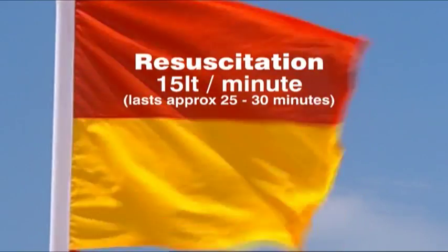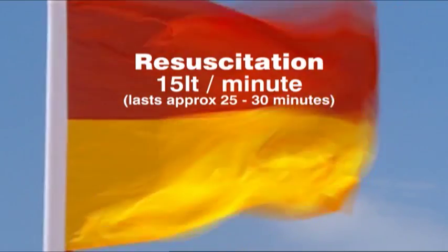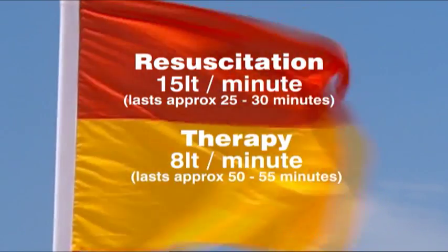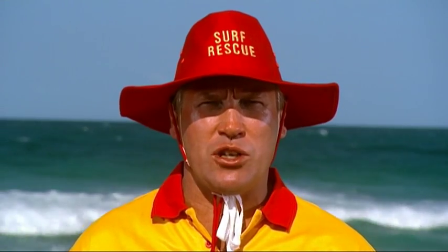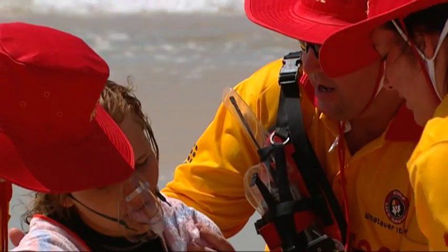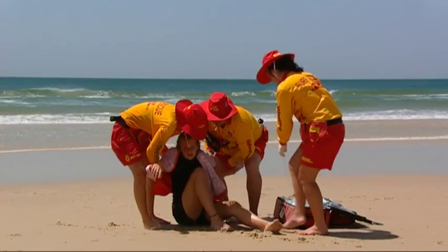Resuscitation, 15 litres per minute, lasting for approximately 25 to 30 minutes. Therapy, 8 litres per minute, lasting for approximately 50 to 55 minutes. The oxygen resuscitators should be checked regularly for cleanliness and contents. There should be weekly maintenance as well as after every use. Members must be trained in this area to use this piece of equipment and are known as the Advanced Resuscitation Operator.